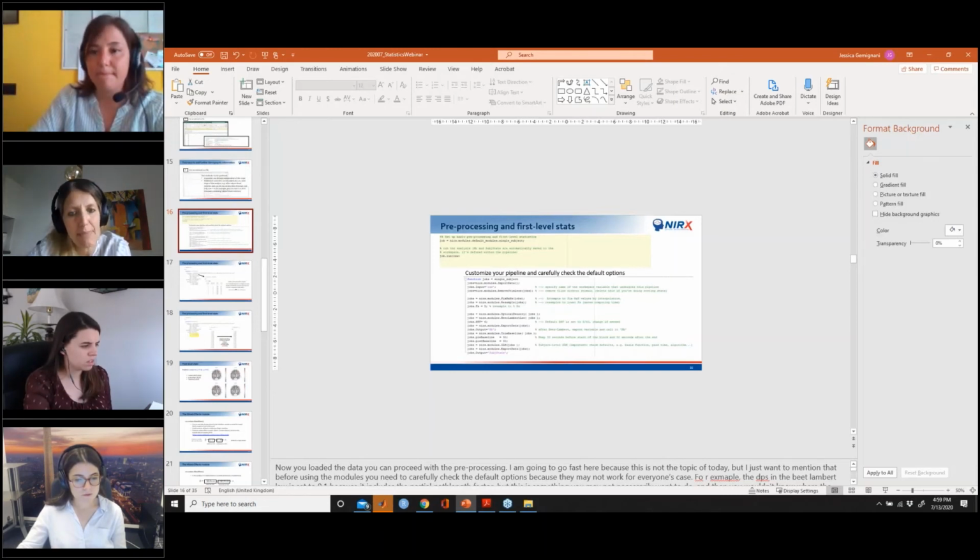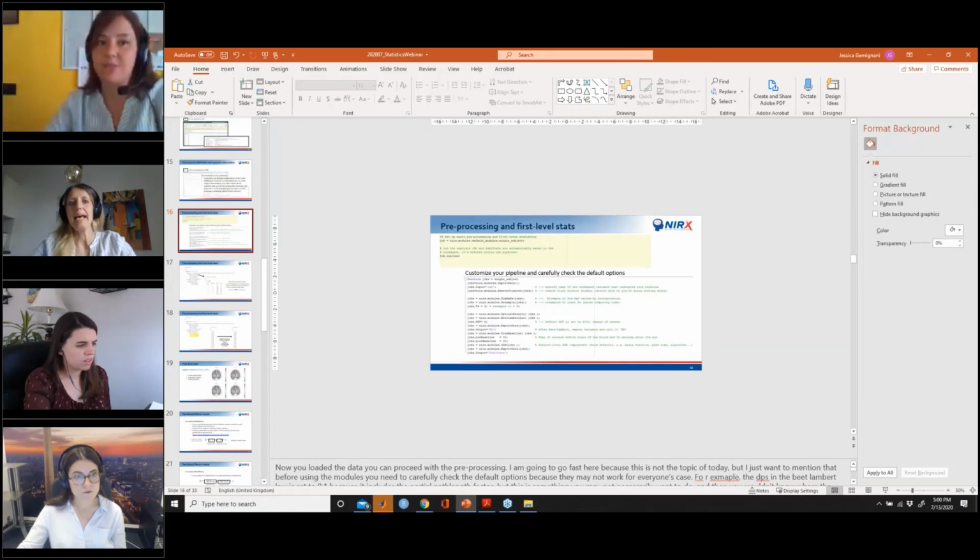In this walkthrough, the same processing pipeline was used for all the individuals in each group, right? And how would you deal with that in the case you need to define different pipelines for each subject, for example, due to different amounts of motion artifacts? That's actually a really interesting question. So I'm not sure I understand. If he means what to do when the preprocessing needs to be different for each subject? For each subject, yes, exactly. Is the process the same?